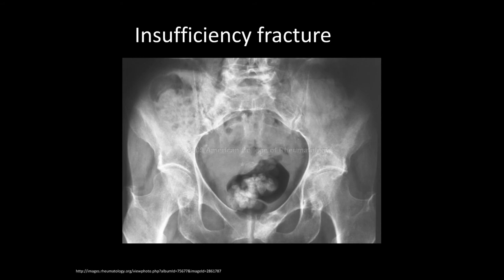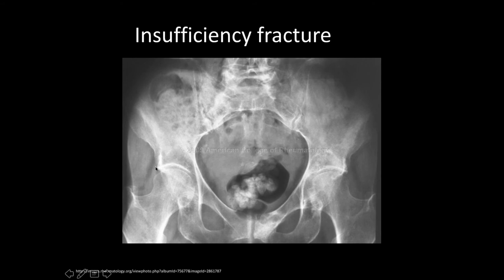Insufficiency fractures — here there's a fracture of the left pubic body, causing increased density. Oftentimes where there's one fracture, there's another, and insufficiency fractures can happen all around the pelvis. When you see pathology, you always have to look for the next one. There might be something happening in the right sacroiliac region — I'm not sure. Here you can see why it can be really difficult because fecal shadows can obscure things. But this is a good example of insufficiency fracture, and also a good example of the different densities — the lucent gas in the rectum, muscle shadows, and fat planes separating muscle groups.